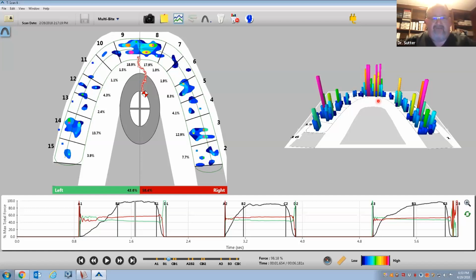So the nuance there of, well, okay, what was he doing and how come he doesn't have this? That's a great question. I can't speak intelligently on what another doctor uses technology-wise or not. Sitting in my chair, looking at this, I can tell you that this configuration can't stay like this for decades, because she's going to start chipping teeth. And then when she's in her 30s, she's going to become self-aware and think, you know what? This chipping thing's been going on for a while. And maybe I'll go get some veneers. And then you prep veneers and you don't have this information.